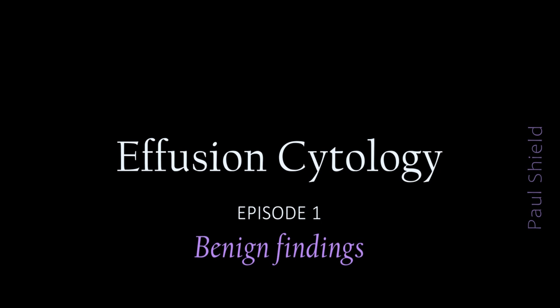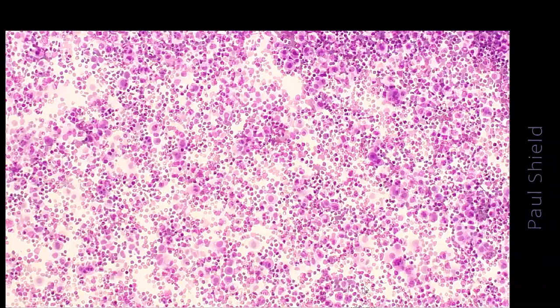Hi, it's Paul. Let's check out normal serous effusion specimens. Now I'm going to concentrate on the morphology of mesothelial cells, because that's the key, I think, to diagnosing fluids. Here is a normal fluid specimen.